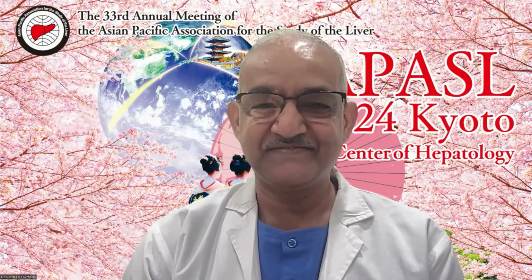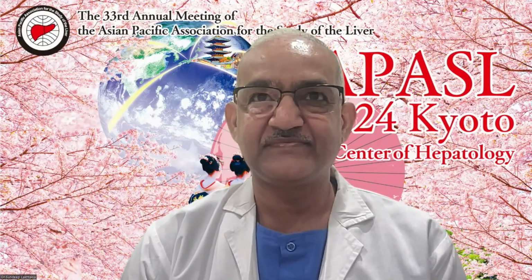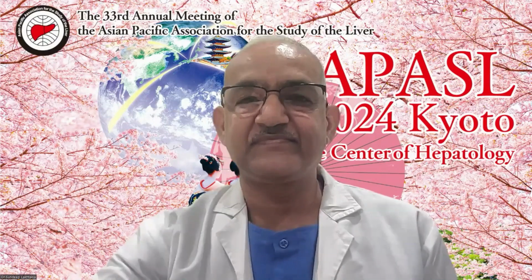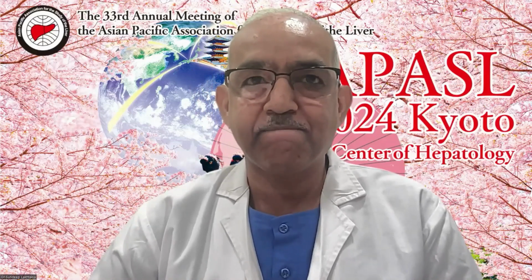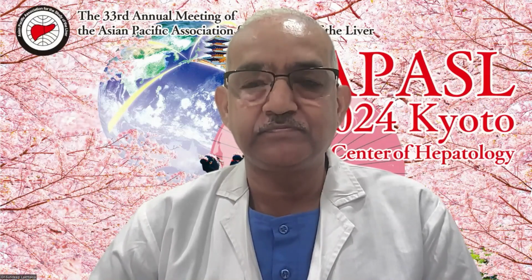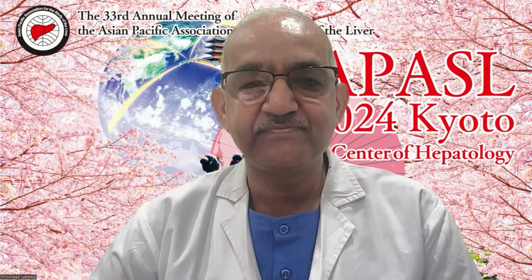I have a question. In my view, EUS-guided coil or glue is better than endoscopy because we can see in real time and we can obliterate the majority of the gastric varices. But how about BRTO? Actually, the principle of BRTO is the same, but they block the shunt from the splenic vein, so they can inject a large bolus of glue or whatever, and they don't care about embolization because they block the outflow.